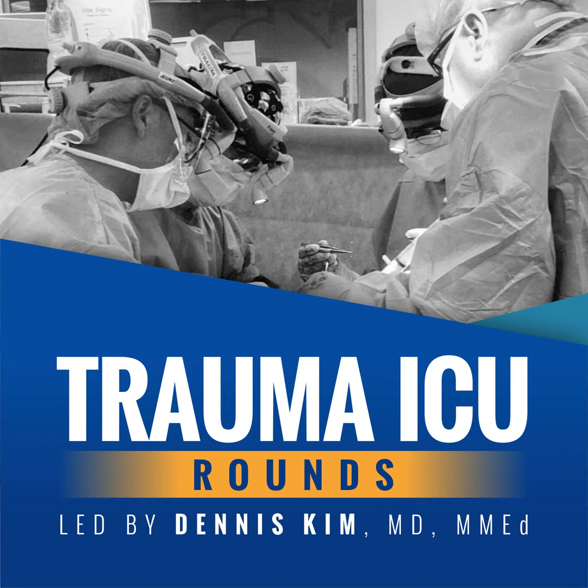And there's a few important points to bring up when it comes to determining can we remove the artificial airway or endotracheal tube. Now, starting from the top and making our way down, the first thing we want to do is assess airway protection. And this really is the ability to guard against aspiration during spontaneous breathing. And from a neurologic status or mental standpoint, we want to make sure that our patients are ideally extubated awake, alert, and able to follow commands and participate in their care. So if we need them to cough, they're able to do so in order to help with airway management and secretion clearance.